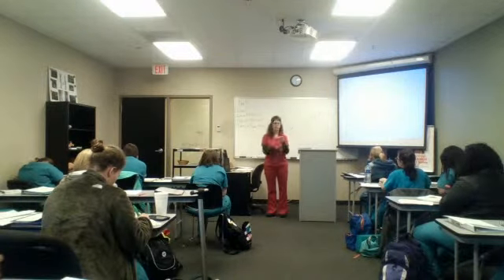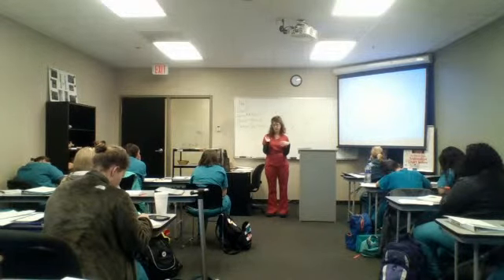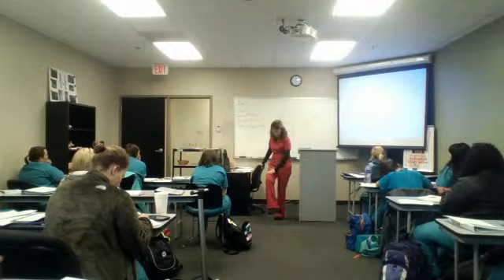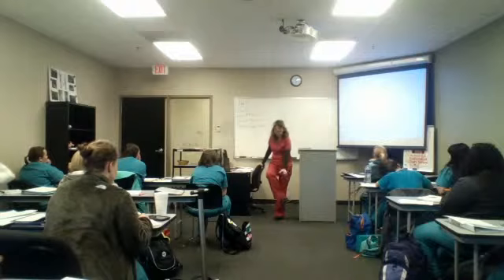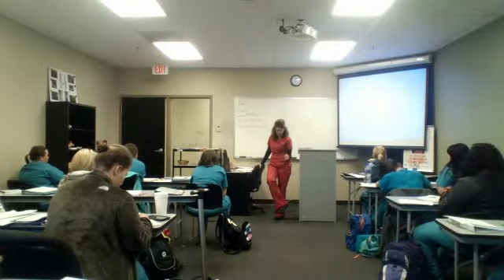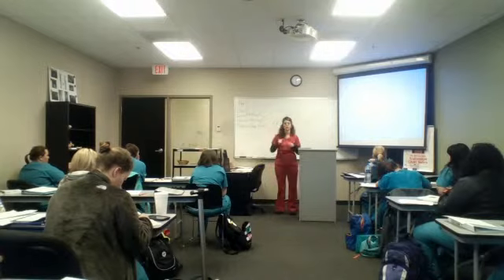And what you'll do is you'll lengthen your vein out in your Doppler, just like you've been Dopplering arteries. Okay, blood should be below the baseline. Augmentation means you'll squeeze below your probe. So if my probe is here, I'm going to squeeze here. When I squeeze, that acts like a pump and pushes blood up the leg. All right? So once I push and squeeze blood up the leg, you should see blood actually go on the opposite side of the baseline and wrap around it.